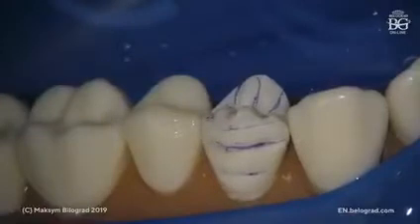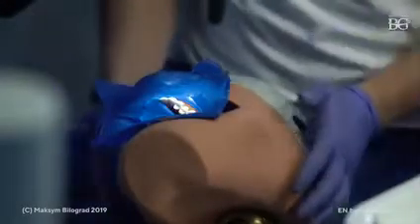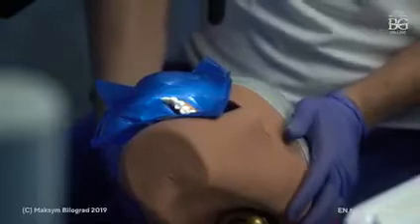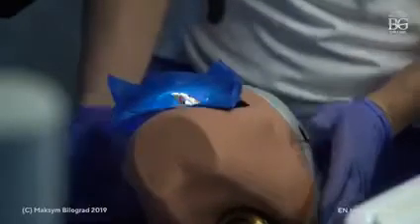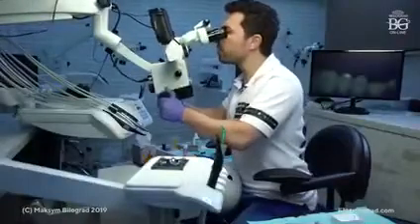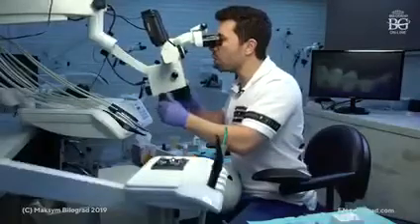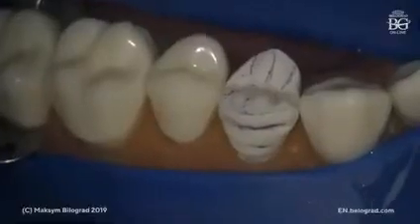If you want to get all the benefits of working with the microscope, with direct vision, you can now ask your patient to move the chin up. Okay, chin up. You move your microscope forward and tilt it towards yourself, so you will be able to see the occlusal surface this way.